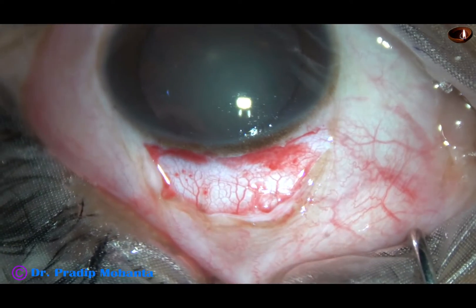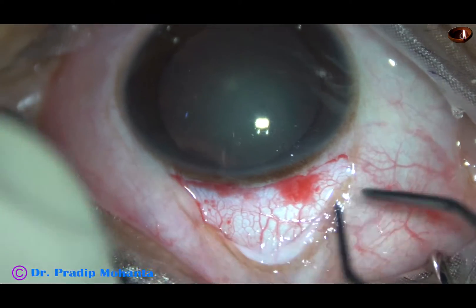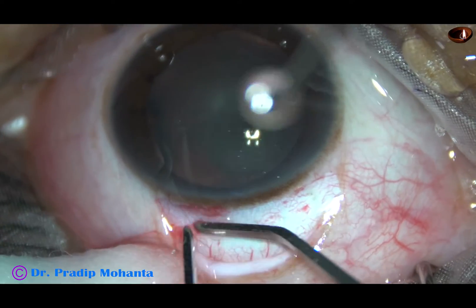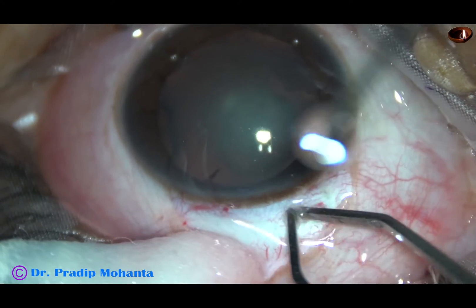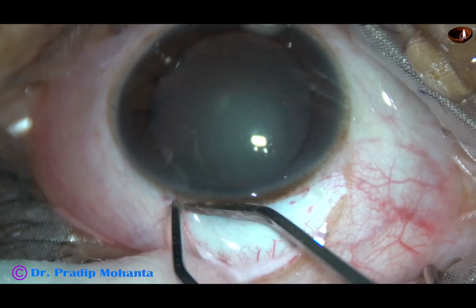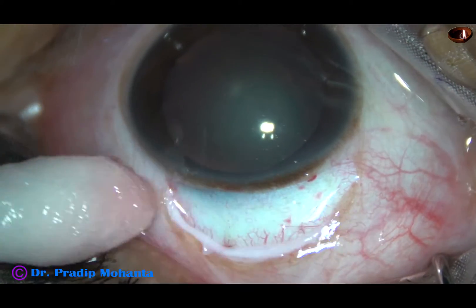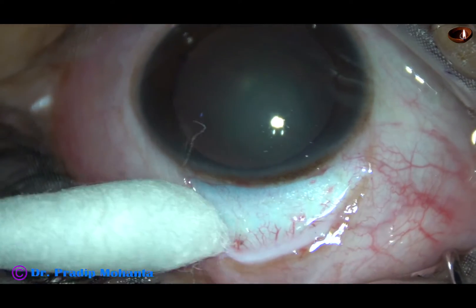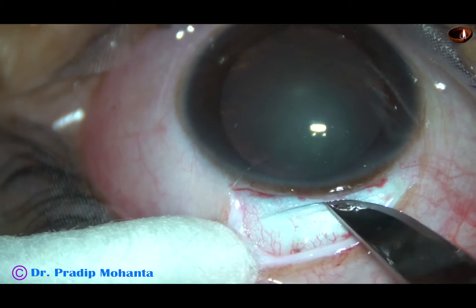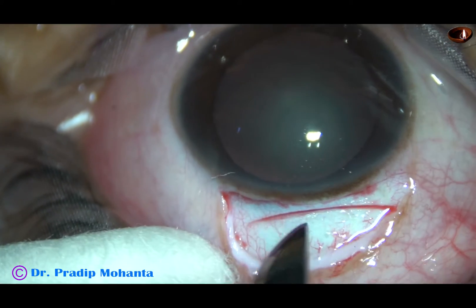Now I am going to use bipolar wet field cautery so that I can make a neat sclerocorneal tunnel. If it bleeds, it is difficult to make the sclerocorneal tunnel. Many surgeons do not like to make a sclerocorneal tunnel without bipolar wet field cautery. Now this is the groove.